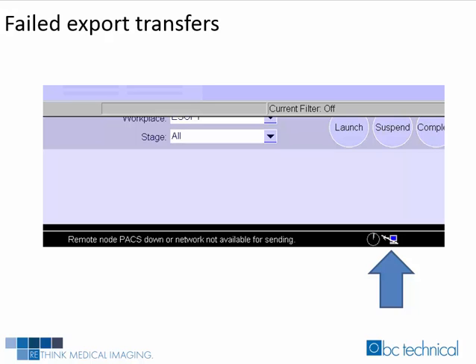After exporting, sending, or transferring the patient's data, the workstation gives you an update on the bottom of the screen. This will tell you whether it transferred successfully or failed. This particular error is from a standalone workstation set up on a PACS for this example, and the workstation is telling us that it cannot find another computer in the network. The most important piece of information you see from the status is the computer icon with a line across it located in the bottom right corner.